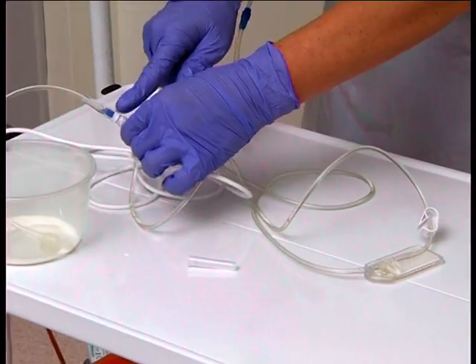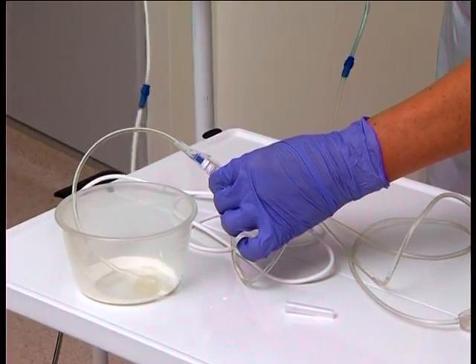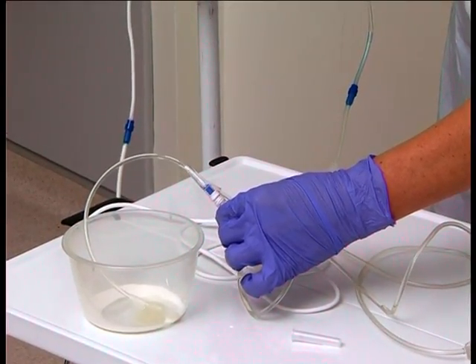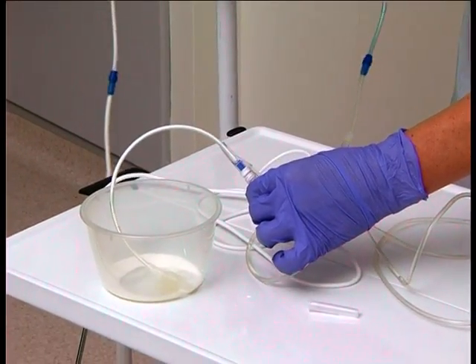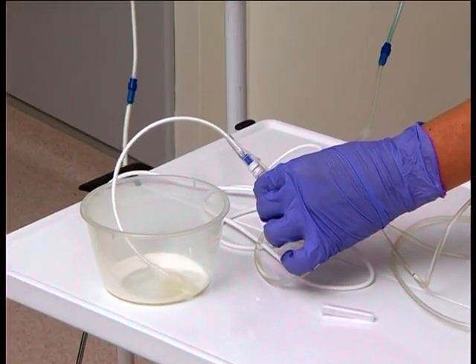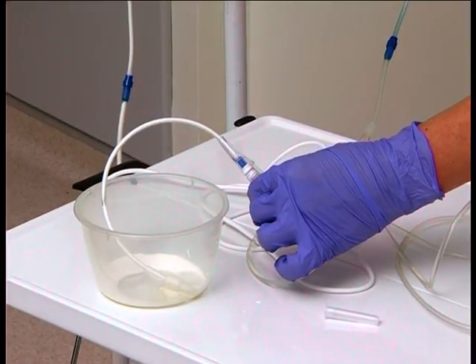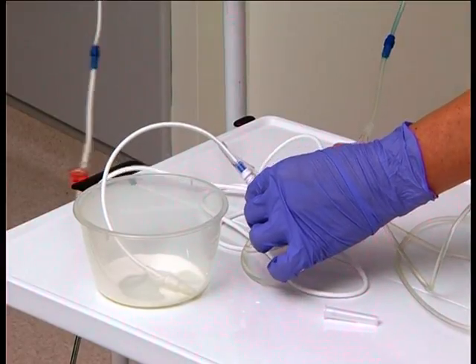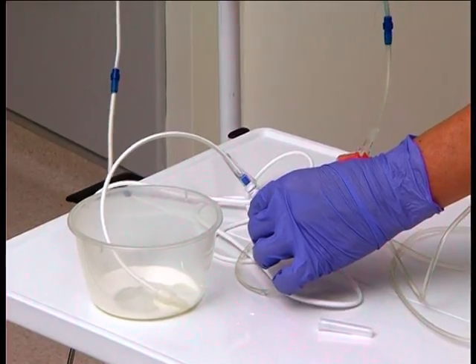Once the fluid reaches the junction with the fat infusion, release the roller clamp on the fat infusion set and allow any remaining air to flow out. Close the roller clamps on both infusion sets to stop the fluids running.